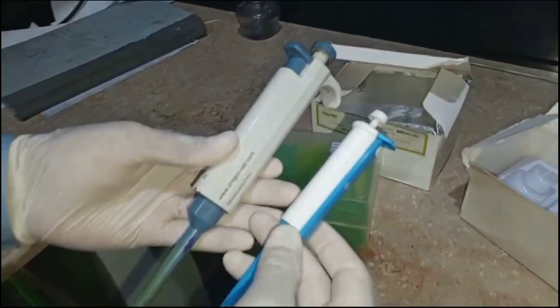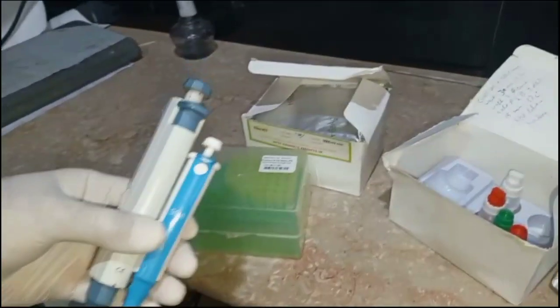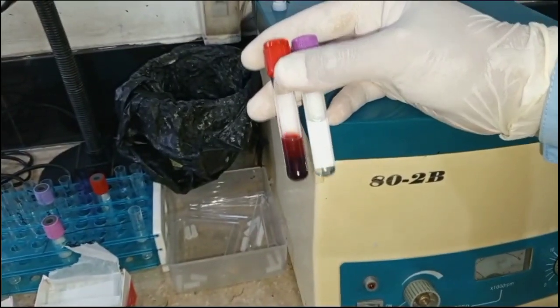So this is a little bit about the kit. Now we also need yellow tips and a pipette. Now let's see the procedure of this test.